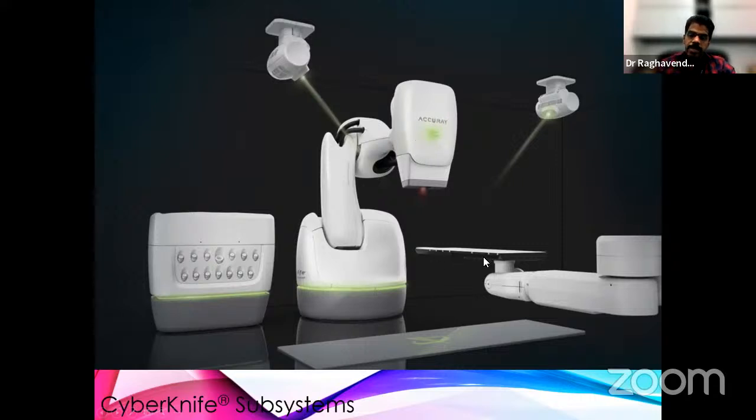So the patient will be lying on that. Further, this can be robotic or non-robotic. You have all the pitch, roll, yaw and XYZ on the couch, plus another 6 motors or joints which can position the linear accelerator at any angle. That is the advantage, and the positional accuracy of this is about 0.2 to 0.3 millimeter. That is what you can claim on a CyberKnife. That is why we say this is a complex machine, but it is very useful in tumors of very small size, like the neuralgia cases.